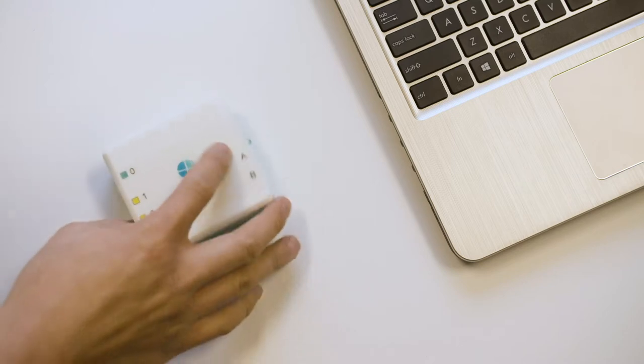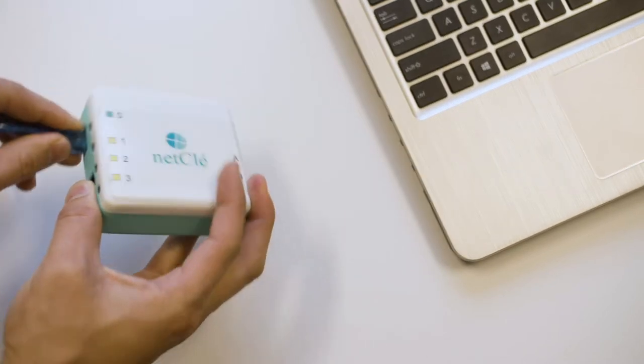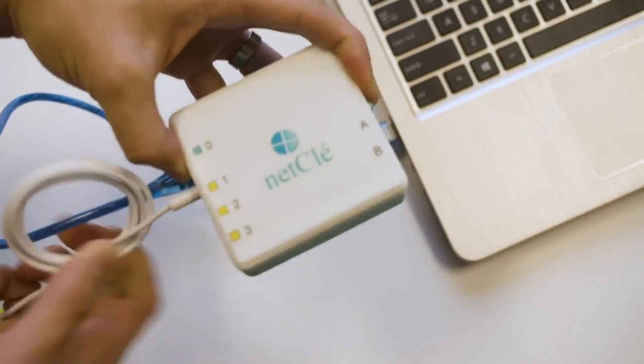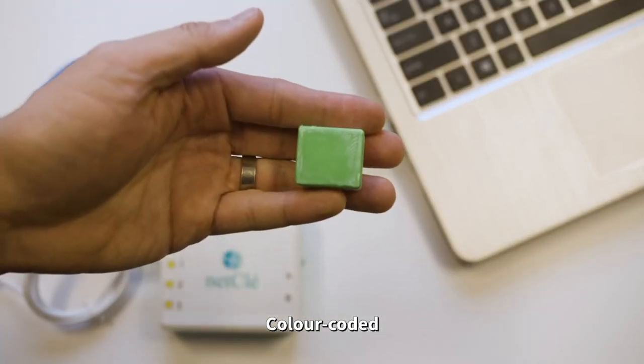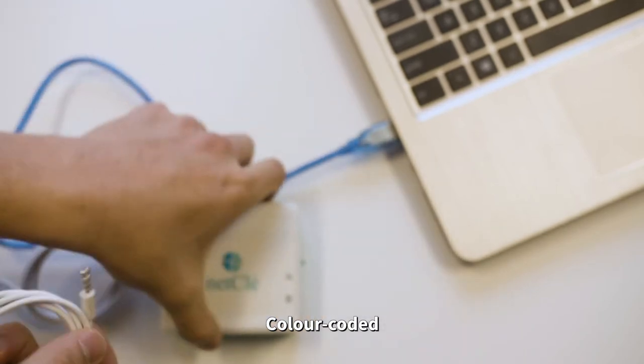Once the configuration software has been installed, the netClé hub can be configured. Plug in the netClé hub. There are a wide range of peripherals that can be plugged into netClé. Peripherals made by netClé are color-coded yellow and green to make it simple to connect them to the correct port. Please check your peripheral's color before plugging it into the appropriate input.